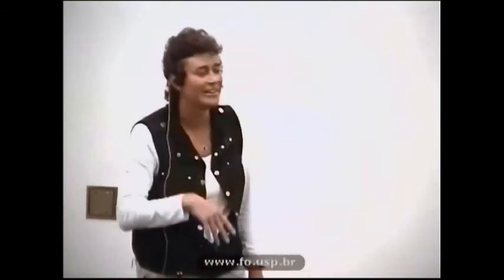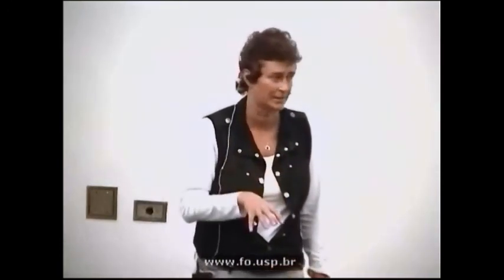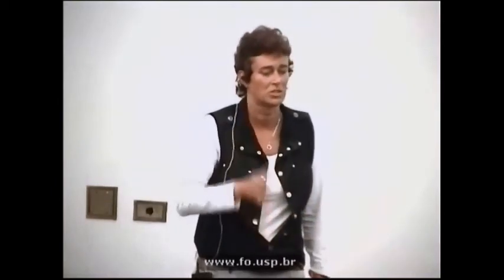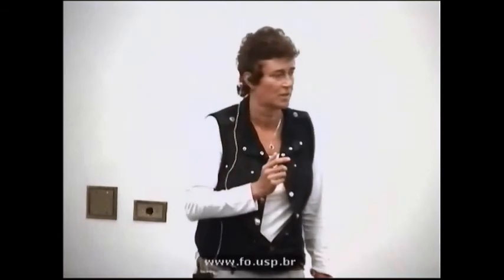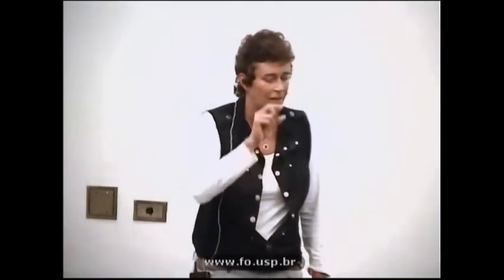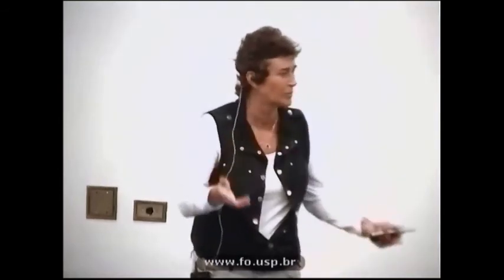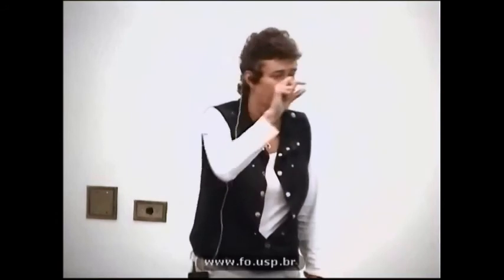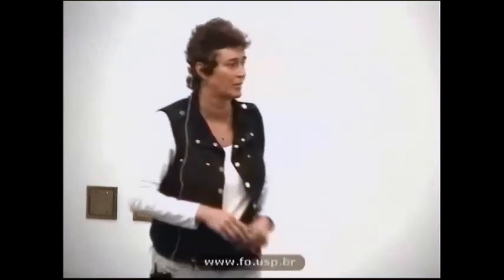I don't know what they did. I don't know if they sandblasted or not. I can tell you, if the fit is fine, and with a good CAD/CAM machine it's a good fit, I go with glass ionomer. Unless I have a height problem. The classic prosthodontic question, a little molar 2 millimeters in the back, then I will bond it.